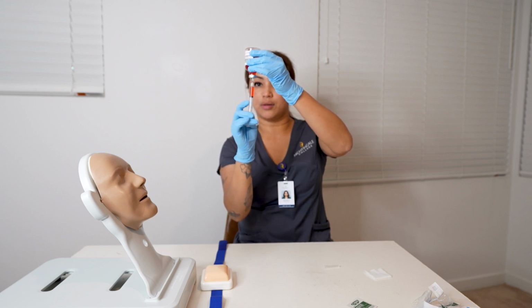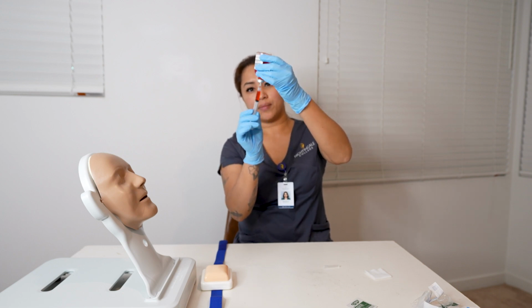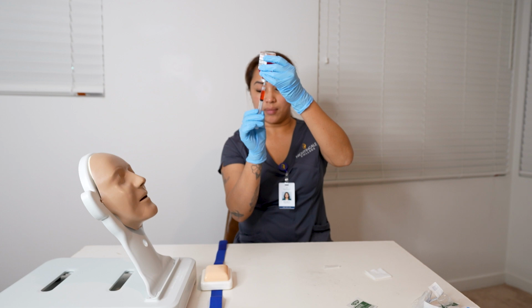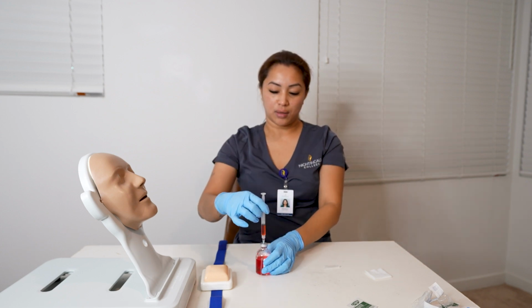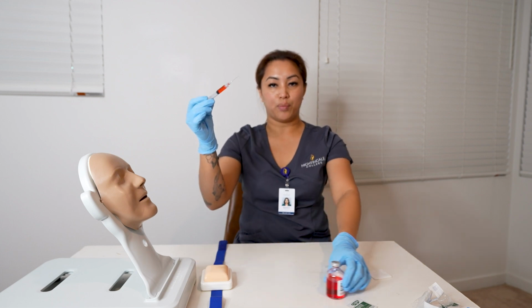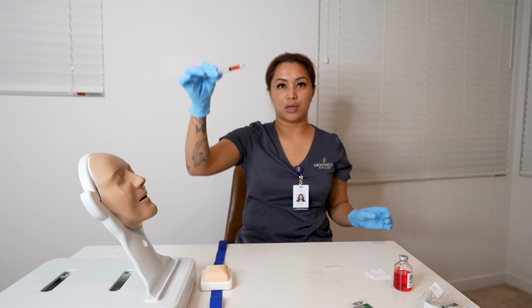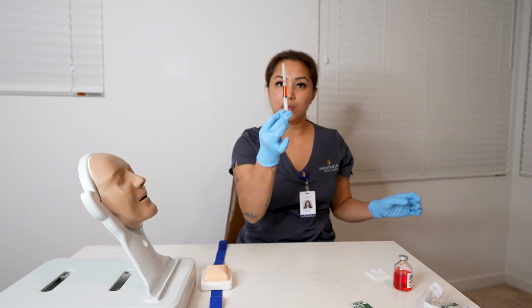Making sure that there are no air bubbles. There's no air bubbles. All right, we're going to invert it again. So now I am going to take it out, put the medication vial on the side. So now I'm going to do the 1 scoop method.